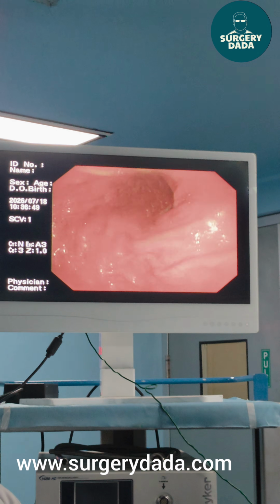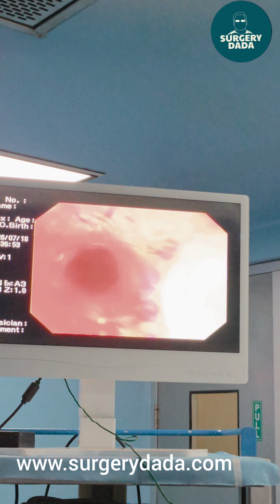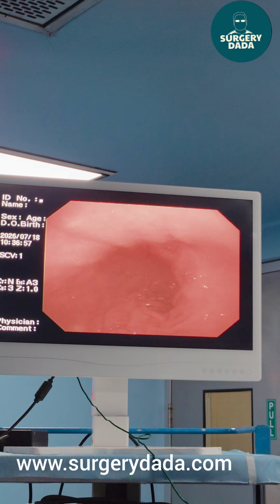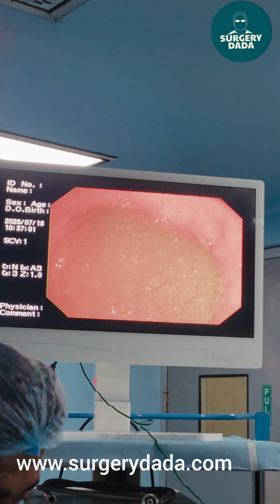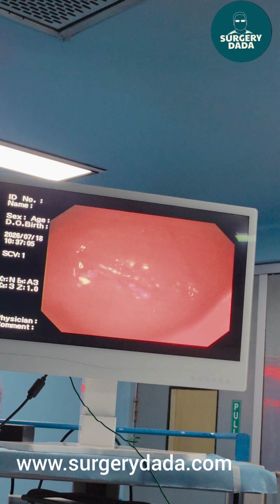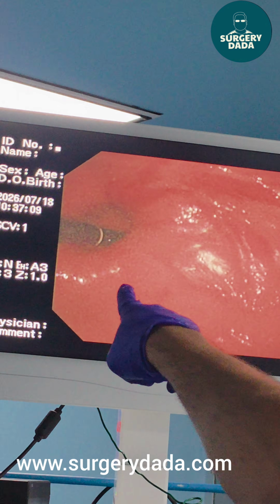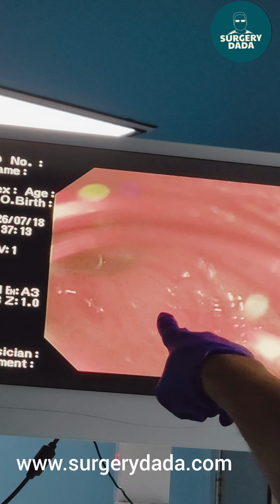Can you see earlier the scope was not able to negotiate into the stomach. So after dilatation, we are able to negotiate into the stomach. Now these are the gastric folds. We'll do a J maneuver to show you what is inside. Okay. So can you see a classical large hiatus here?